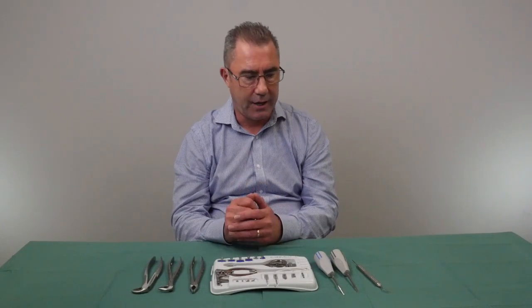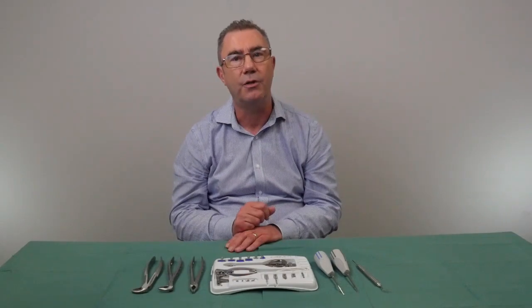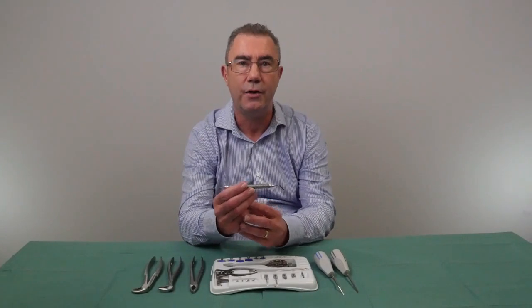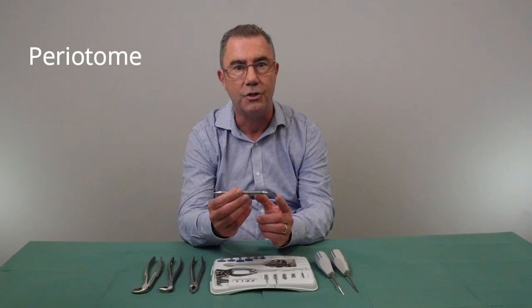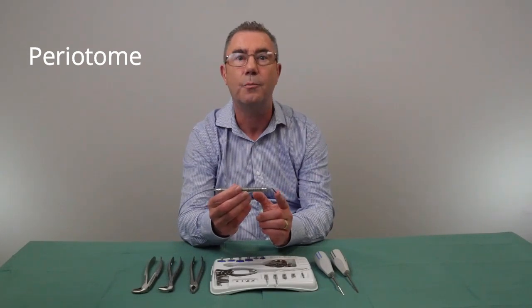The first stage is atraumatic extraction, and there are a variety of instruments available to enable you to do that. The first one I want to talk about is called a peritome, and this is the instrument most favored by people doing implantology and those who are very concerned about buccal plate preservation.